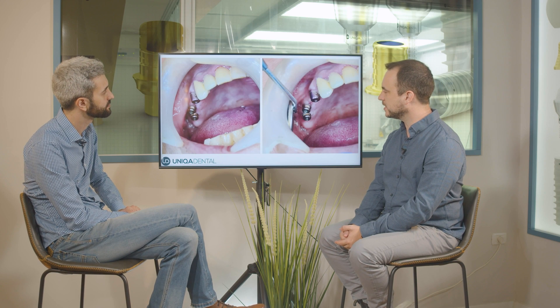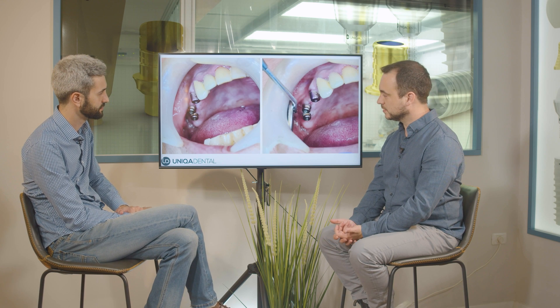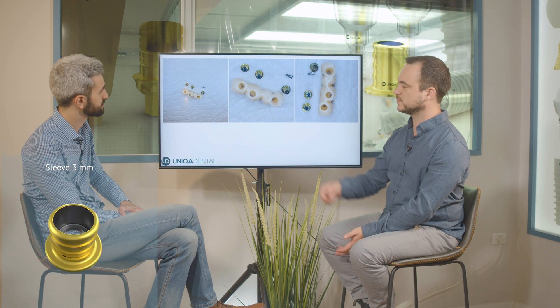This is after the healing process. After the healing process, you can see a little bit of plaque that needs to be cleaned. Right now what we're going to do is take out the healing caps, do two impressions, and make the bridge. In this case, we made a bridge from monolithic zirconia. You can see different types of sleeves — one sleeve is for the angulated multi-unit and the two others are for the straight multi-units.